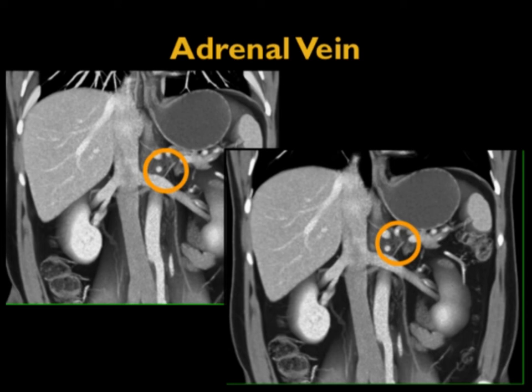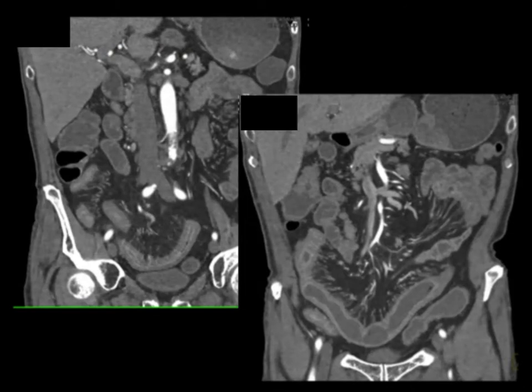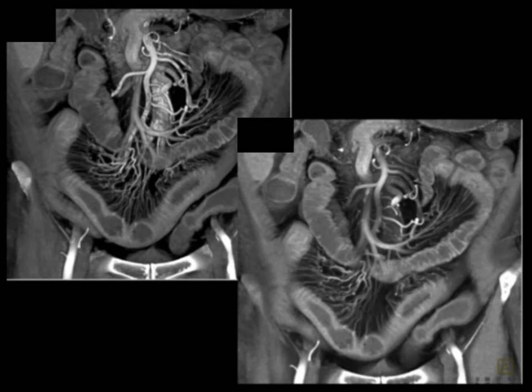People often say if I look at a difficult case, then I'll look at the 3D. But you're still going to miss a ton of stuff. The difficult cases — those are the easy ones. What about the ones you call normal or probably normal? In this case with thickened bowel and Crohn's, as you go from the axial to the coronal, the coronal gives you lots more information, particularly about the vasorecta. But it is still limited as a 2D map. 3D MIP imaging gives a very nice view of the vasorecta up to the level of the patient's bowel — you can see the bowel enhancement and changes with strictures present. Then the volume rendering shows both vessels and bowel, the strictures, the soft tissue. Volume rendering is ideal and supplements MIP imaging.